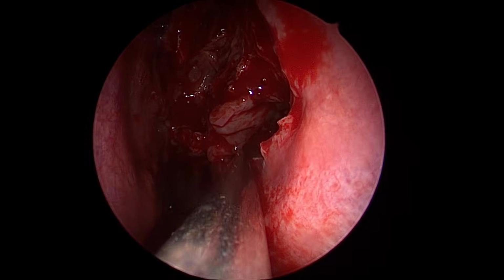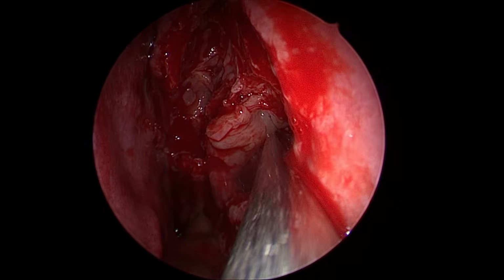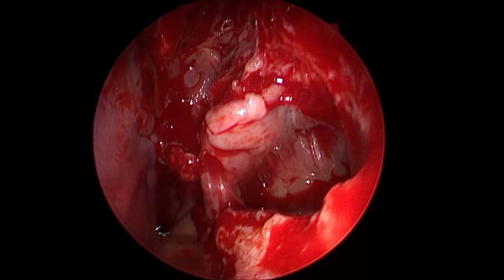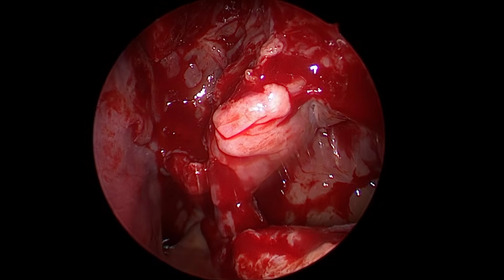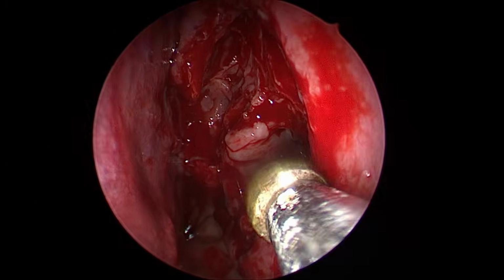Here, looking at the aggressiveness of the disease, you have to take your surgical call, how wide your ostium should be. There is no hard and fast definition. If you don't have an aggressive mucosal disease, you can avoid wide meatotomies.